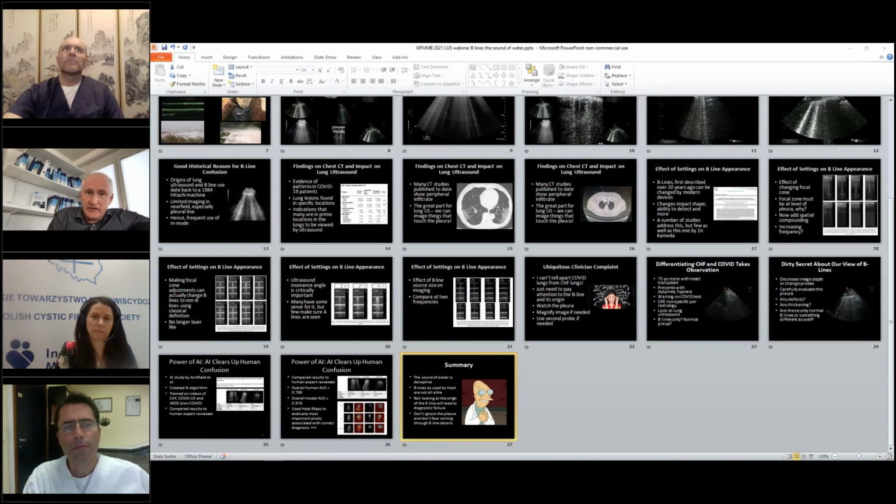And I don't care too much about probabilities below, and I can't exclude. Also, for pleural effusion, I'm interested if there is no pleural effusion, because it has a meaning. If there is little pleural effusion, I have a diagnostic problem to solve why there is pleural effusion. And if I have a large amount of pleural effusion, I treat. And therefore, I'm interested in distinctive answers, and scores do not play a big role in my life.